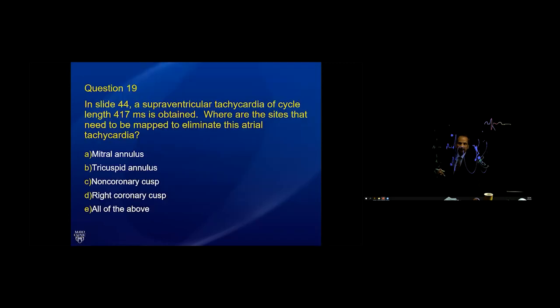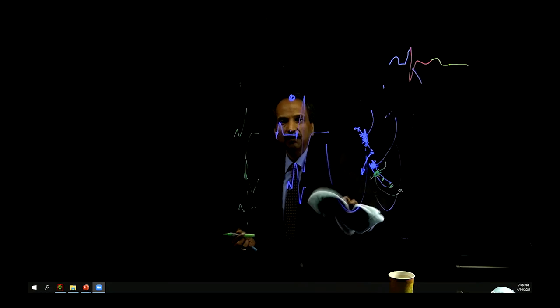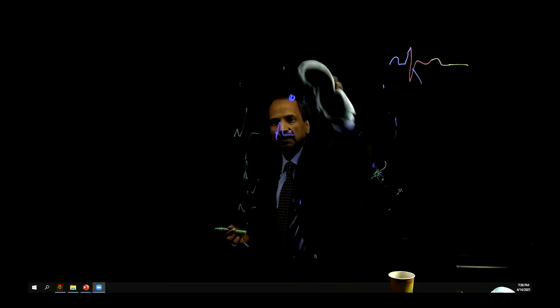And if it is an SVT, and if we had only these beats all the time, with the VA very short, HA short, we'd say it's AVNRT. And then the thought process became more on what type of AVNRT can we get more V than A? We then defined it to be a type of AVNRT where we have this so-called upper common pathway block. And it was slow pathway ablation that was curative in that patient.